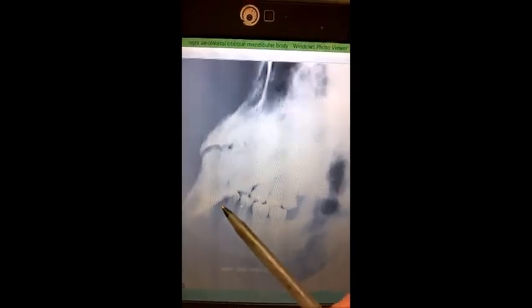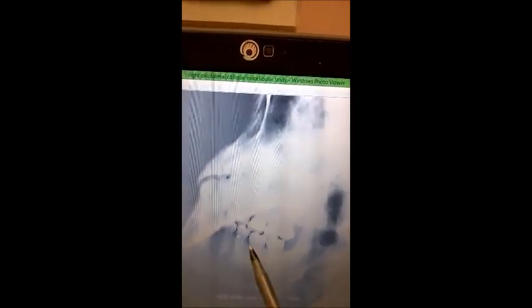Here we have the right axiolateral oblique mandibular body view. So the mandibular body of the right side is right here, and the left one is up here. Now there should be no superpositions of these two, as well as no foreshortening of the body or rami. And this criteria also fits for the left axiolateral oblique mandibular body projection.